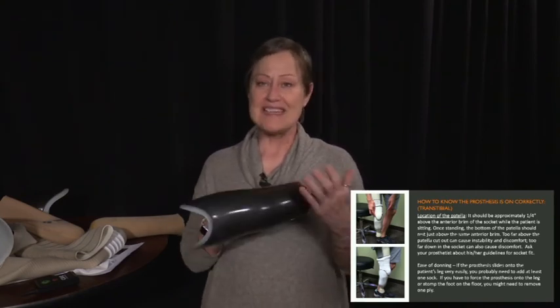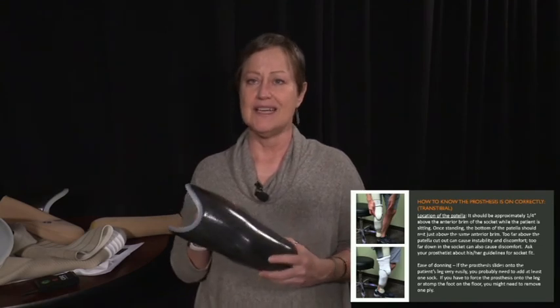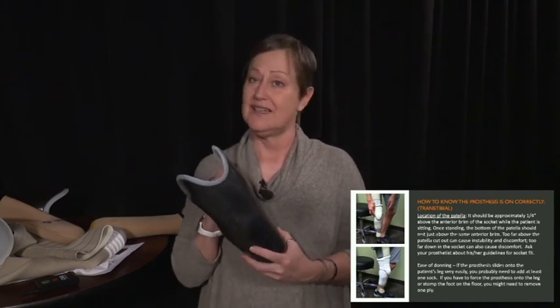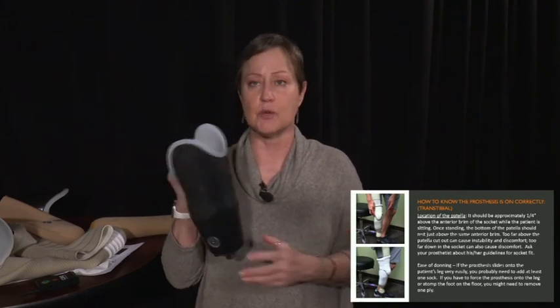Also, as I said, at the beginning of an appointment, I'll have the patient doff and don their leg again. If that leg comes off really easily and goes on really easily, then I start to be concerned that they need to add socks, or there's too much room in there.